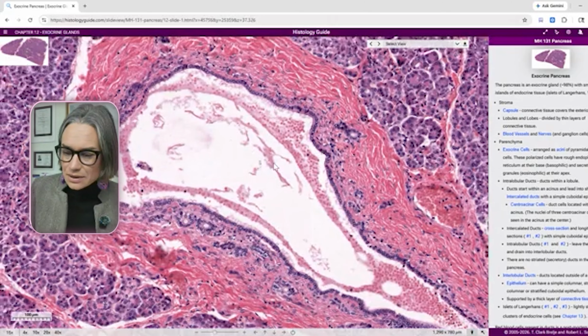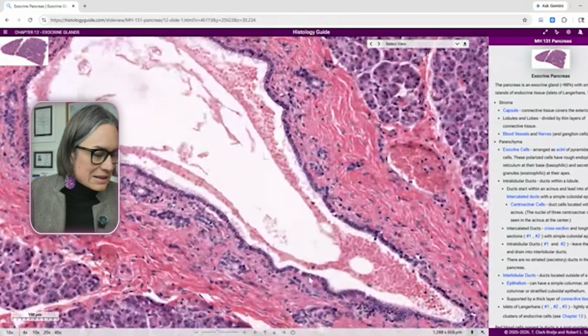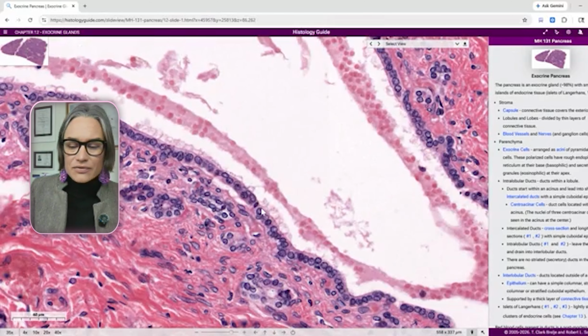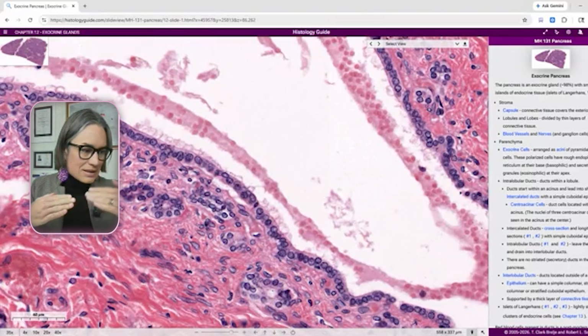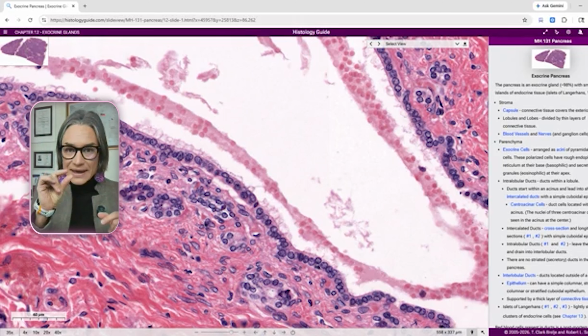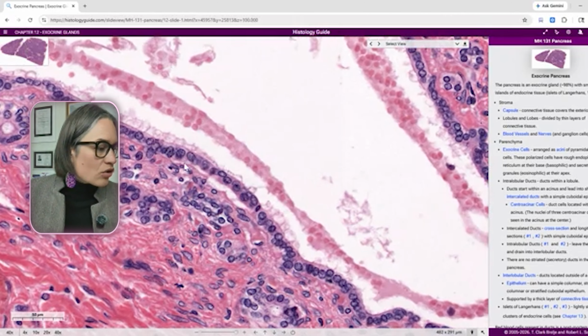I don't know why we have blood here. I think it's just contamination in the preparation process, but you can beautifully see that the lining of this is not what we had for arteries and veins. Arteries and veins had a super flat lining, the endothelial cells, and then the tunica intima. These cells are flat, or when they're contracted, they're wavy, but the thickness of the layer is small. Whereas here you can see that these are cuboidal.